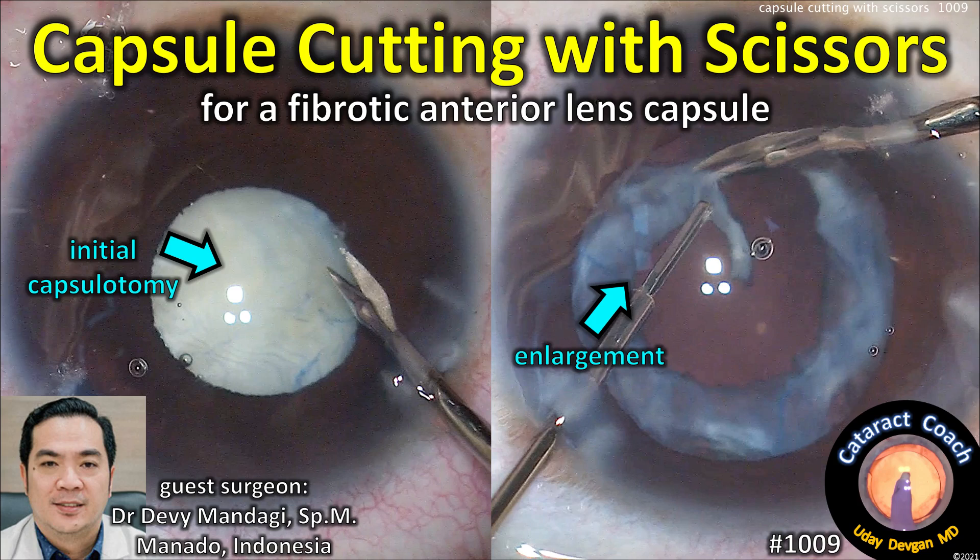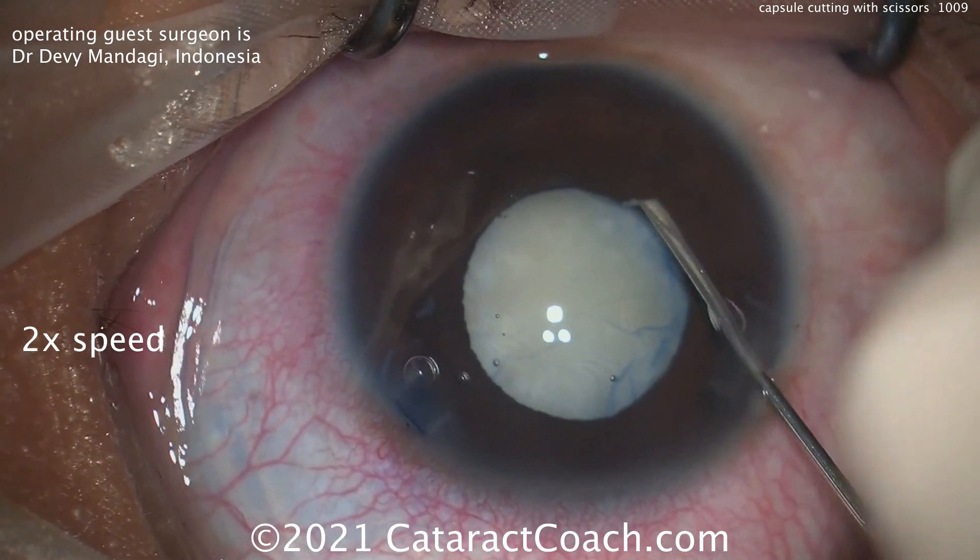CataractCoach.com presents capsule cutting with micro scissors for a fibrotic anterior lens capsule. Our guest surgeon is Dr. Devi Mandagi from Indonesia.